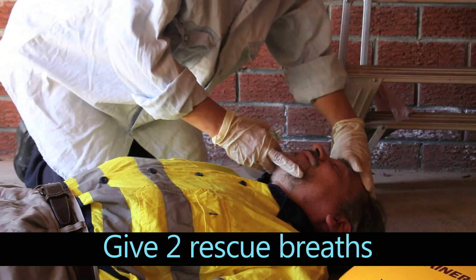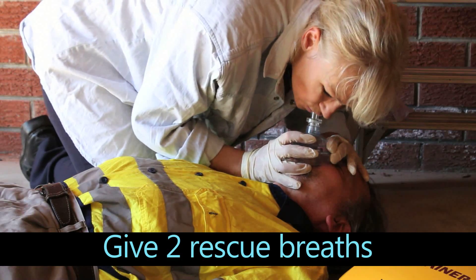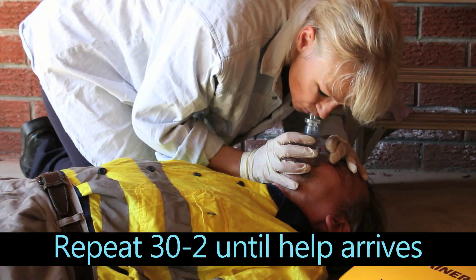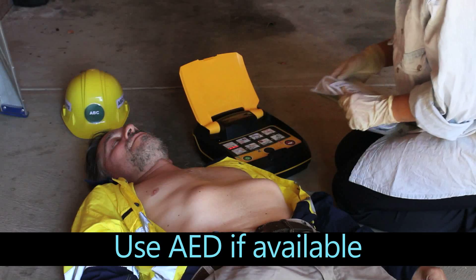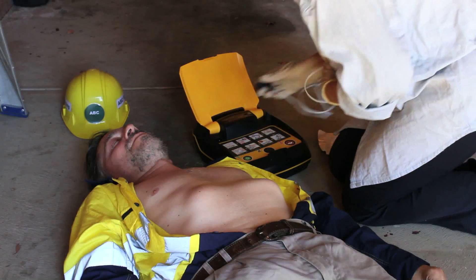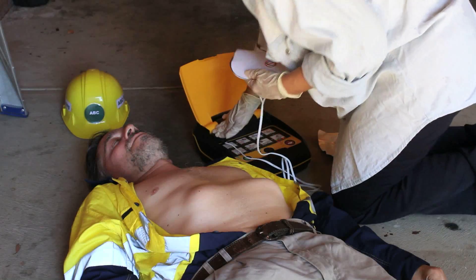Tilt the patient's head back and give two rescue breaths. Continue with CPR until help arrives. If an automated defibrillator is available, turn it on and follow the instructions. Plug in pads, insert connector firmly.